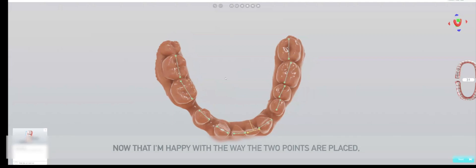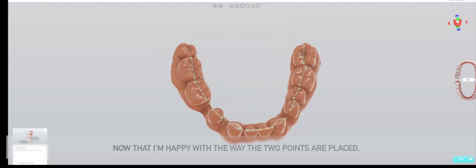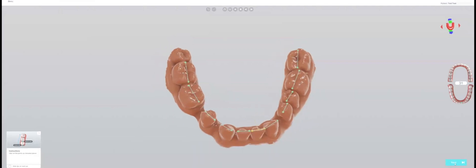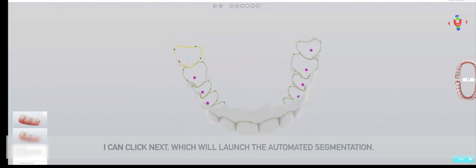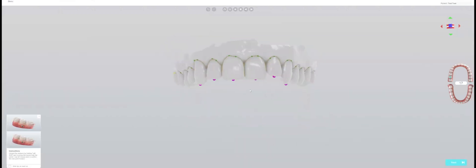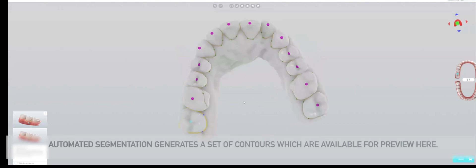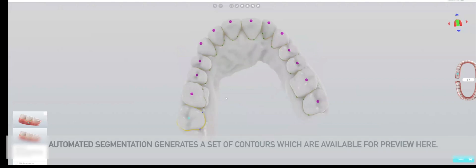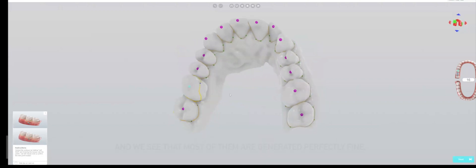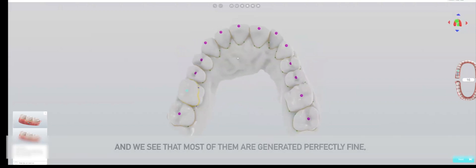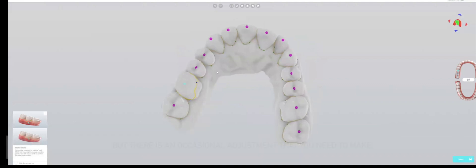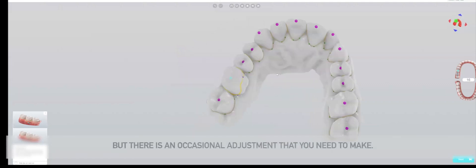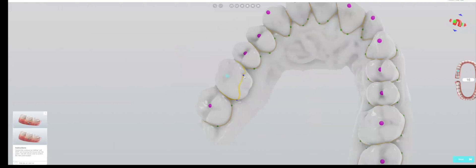Now that I'm happy with the way the points are placed, I can click next which will launch the automated segmentation. Automated segmentation generates a set of contours which are available for preview here, and we see that most of them are generated perfectly fine.